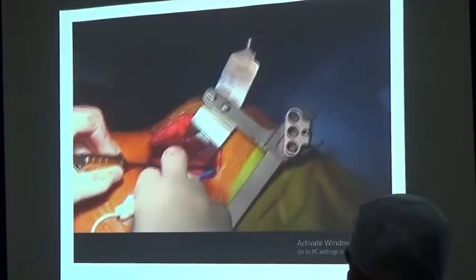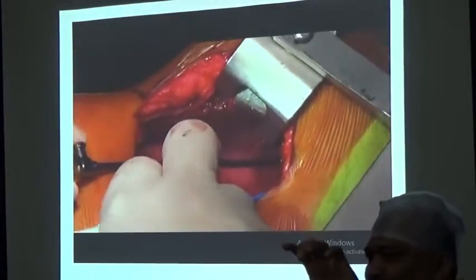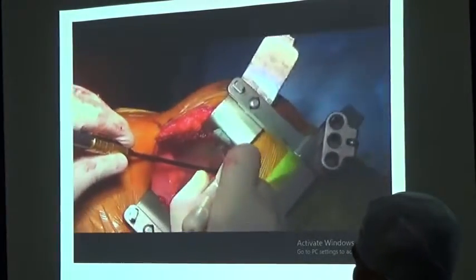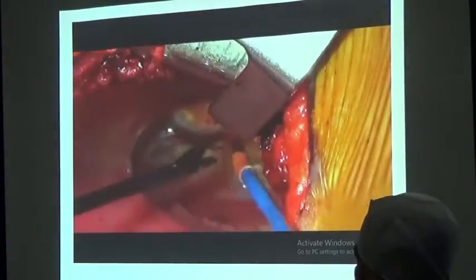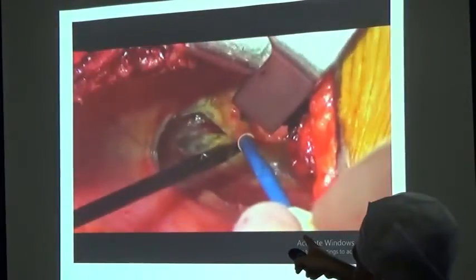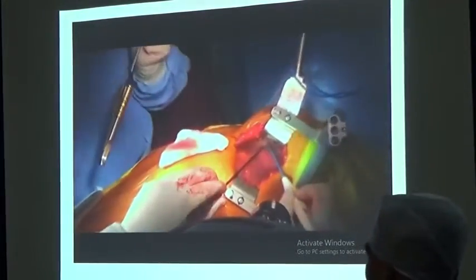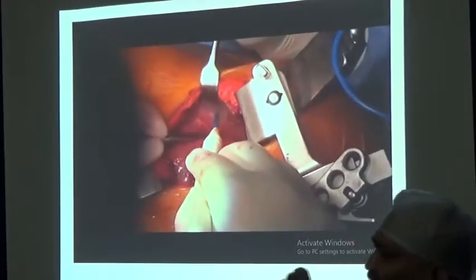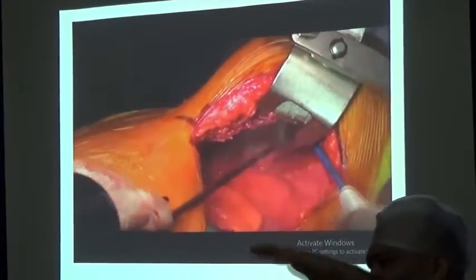The advantage of this is LIMA harvest. Traditionally you can't approach the top end of the left internal mammary artery nicely, whereas in minimally invasive it is just in front of you, and it is very easy to dissect. In fact, there is a long instrument, even the cautery tip is long, almost 10 to 15 centimeters, and it is a collapsible tip, so you can reduce the size of the cautery also. Very easy to harvest the left internal mammary. The difficult part in this is the lower end, whereas traditionally we can very easily harvest the LIMA lower end. The top end is difficult in a traditional sternotomy incision.